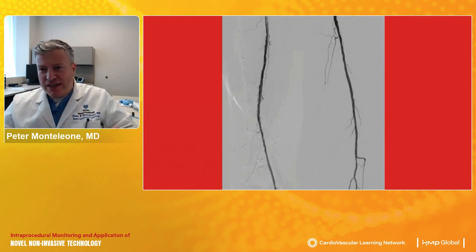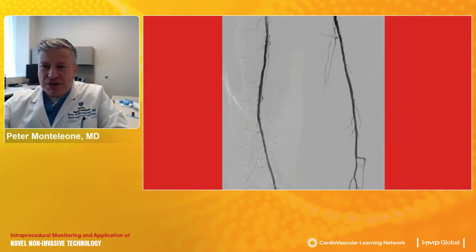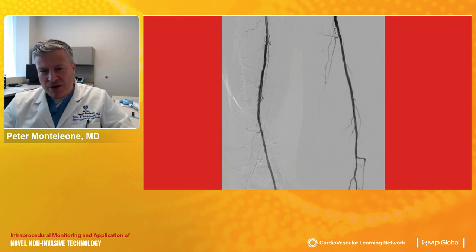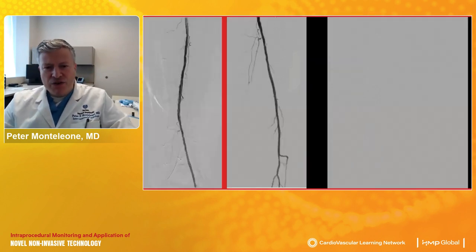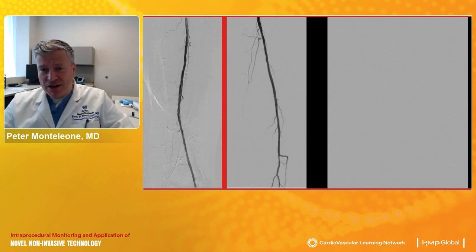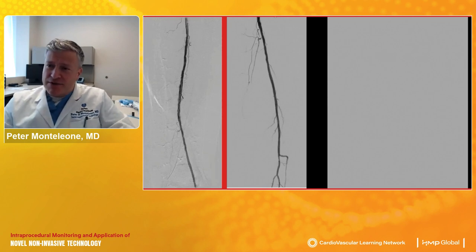You know, we treated that SFA, the question of how completely that was treated, the question of continuing down to the popliteal segment, all fairly obvious. But then again, there's more disease, as we've seen in each of the cases presented, at multiple levels. So as this demonstrates, there's a level of a total occlusion of the posterior tibial artery. Continuing to progress beyond this in a case where we don't have any real-time and non-invasive monitoring besides the angiogram, you'd be making decisions about if you have to keep going.